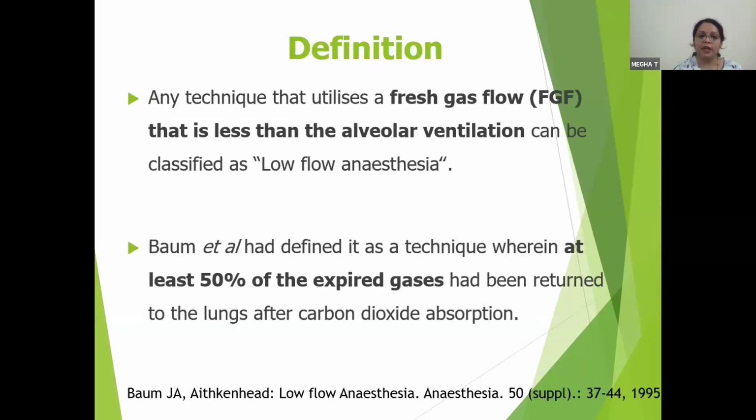So coming to the definition, as I said earlier, any technique that uses a fresh gas flow lesser than the alveolar ventilation can be classified as low flow anesthesia. Baum et al. in his article mentioned that it is a technique where at least 50% of the expired gases are returned to the lung of the patient after carbon dioxide absorption.